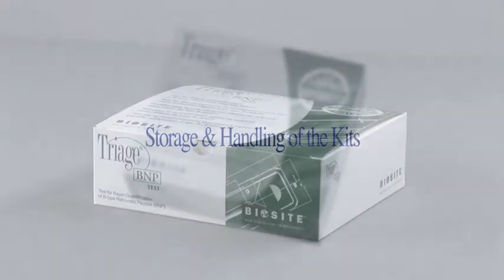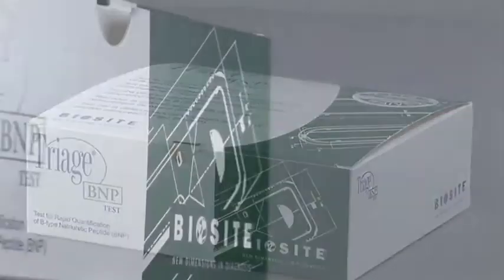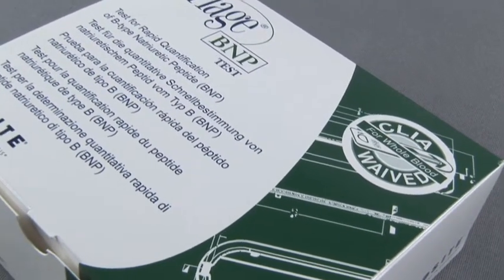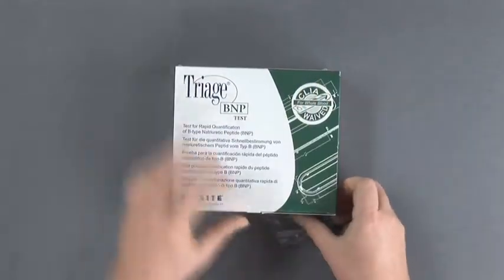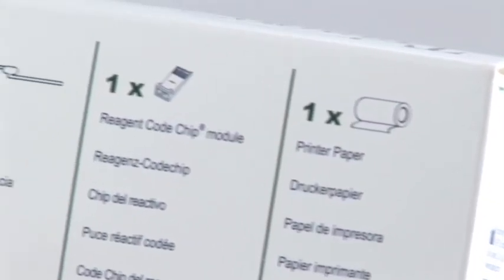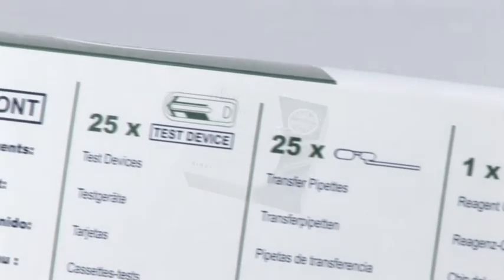Let's review the proper storage and handling of the triage test devices. The triage test kits come in clearly marked color-coded boxes. For example, green is the product color of the Triage BNP. Each test kit is shipped sealed and needs to be opened when testing is ready to begin. Each kit contains enough supplies to perform 25 individual tests.